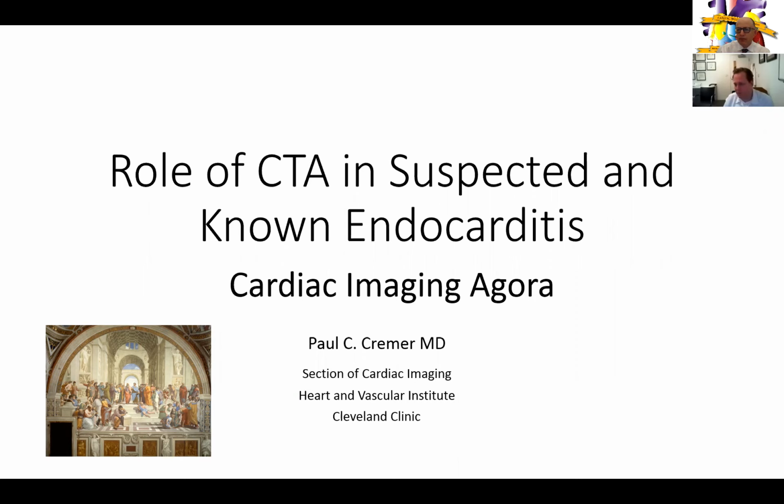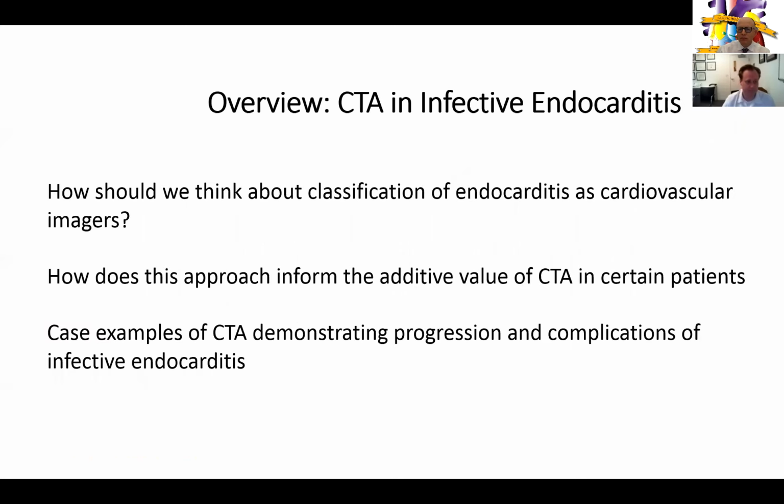So what I'm going to talk about is the role of CTA in suspected and known endocarditis, and this has really emerged over the past several years, and something that we're using more and more as we become more and more familiar with the modality. I would also say that in the current COVID-19 pandemic, where we're minimizing the use of certain procedures such as transesophageal echo, it may be particularly relevant in that setting as well.